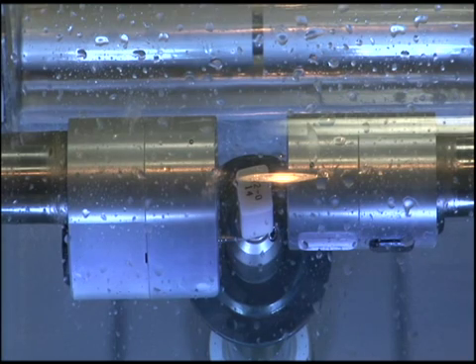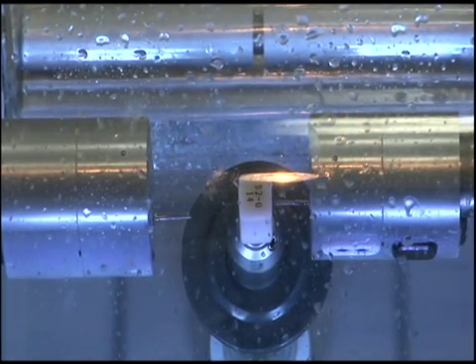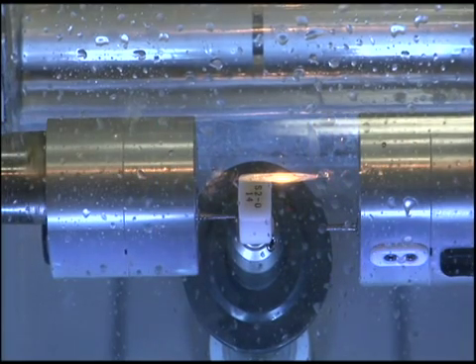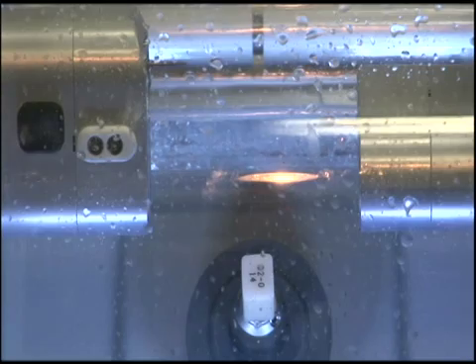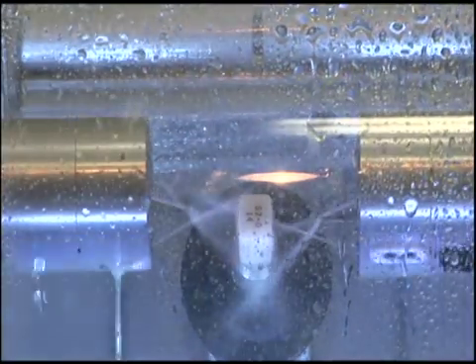The average human being can tell the difference of something in their mouth of a half of a human hair. So we have to make sure that everything that we put in your mouth fits very, very, very well so it doesn't bother you and feel off. So there's our lubricant spray. It's going to bring the crown into proximity and it's going to begin. Each swipe of those burrs takes off just a few microns of material, and in another 12 and a half minutes we'll be able to show you.